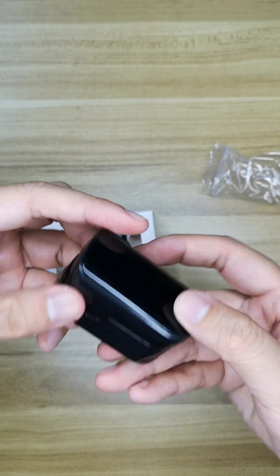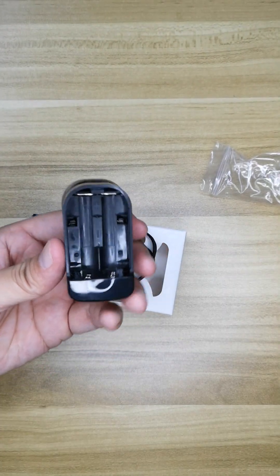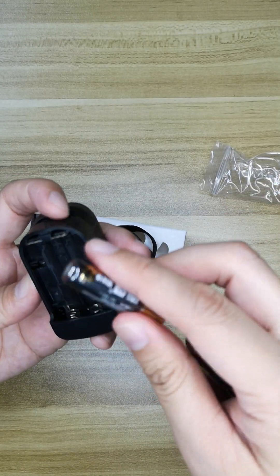Here is the power button. Now we're going to insert our battery. This is the battery. Here is the positive — two positives.